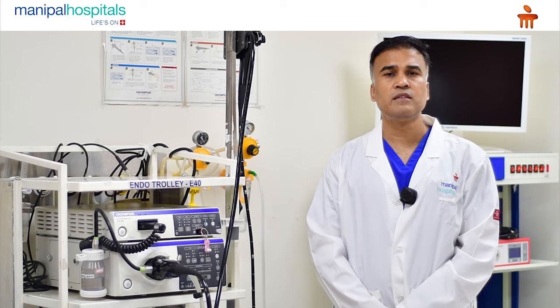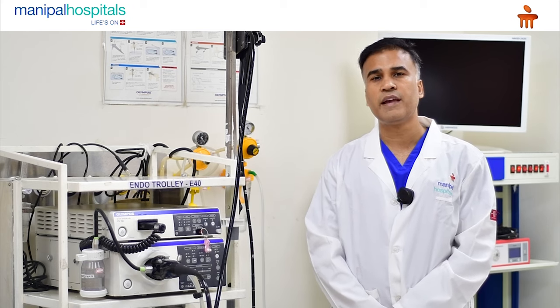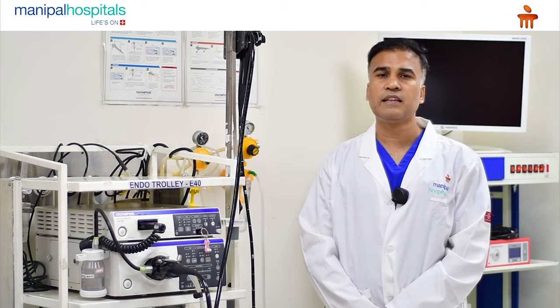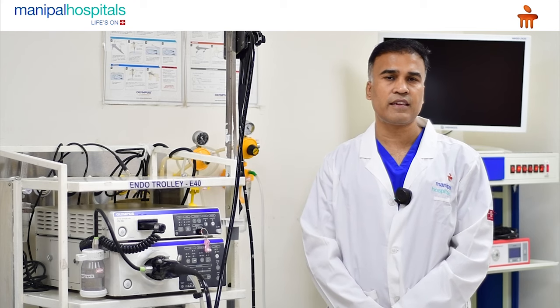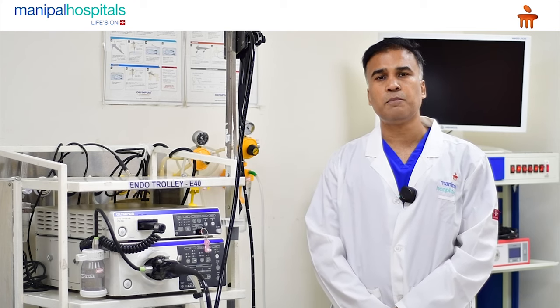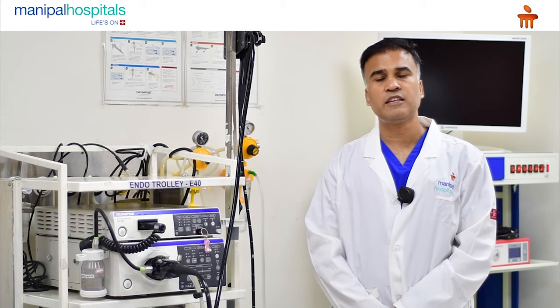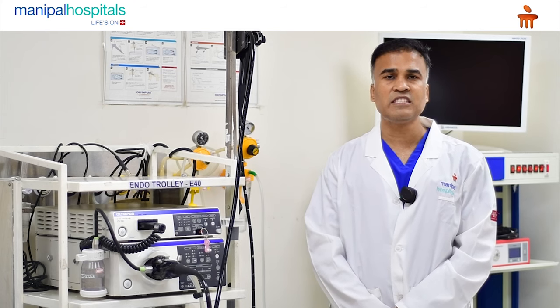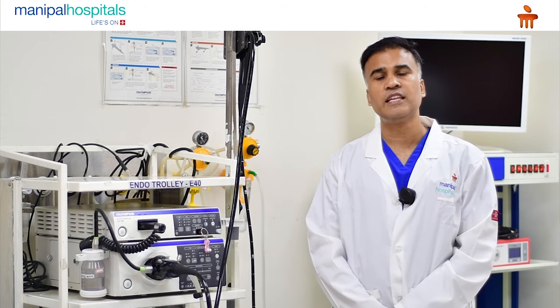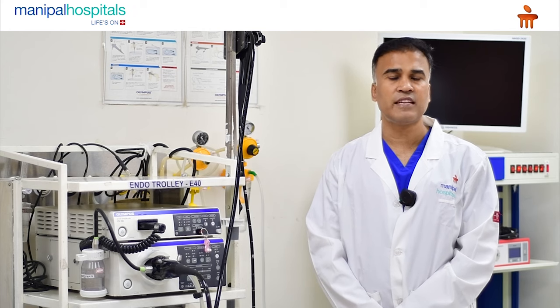The endoscopy is done in either local anesthesia or mild to moderate sedation under anesthesia care. The normal procedure time for upper GI endoscopy is five minutes, especially for diagnostic purposes. If there is any therapeutic work, upper GI endoscopy may extend for 30 minutes.